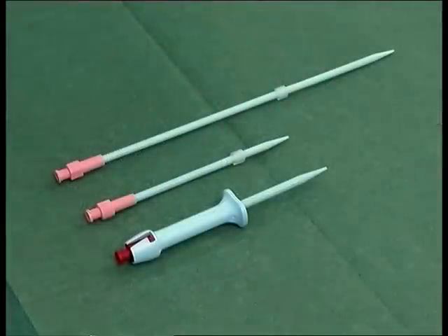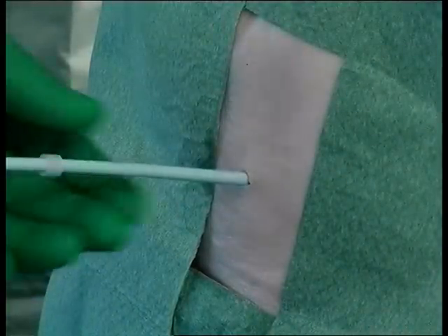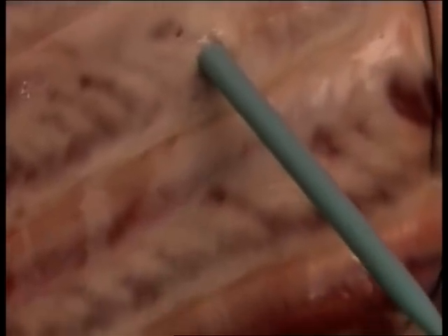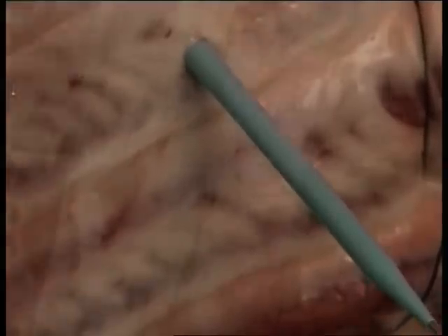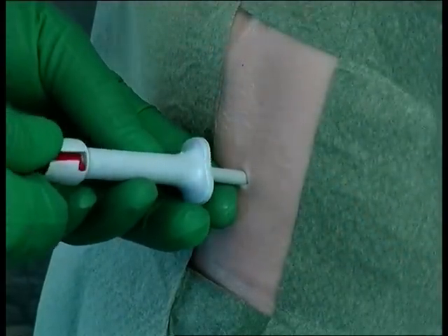Here we see the traditional 20 centimetre dilator, the 10 centimetre shorter style supplied in Medical Seldinger kits, and the latest guarded version. In this example, a standard 20 centimetre dilator is being placed without proper attention being given to the depth of insertion. It's immediately clear that the dilator has been inserted too far, with potentially serious consequences. Here we see the latest guarded version.